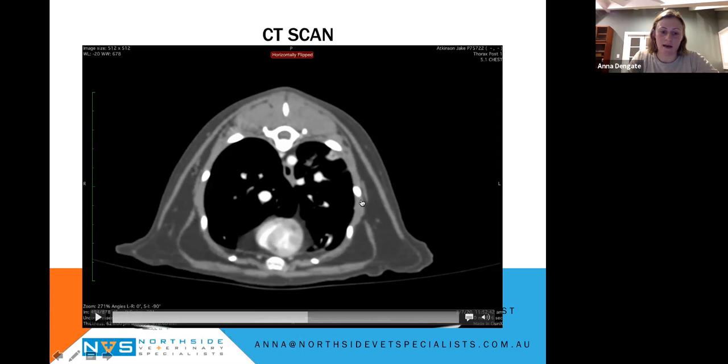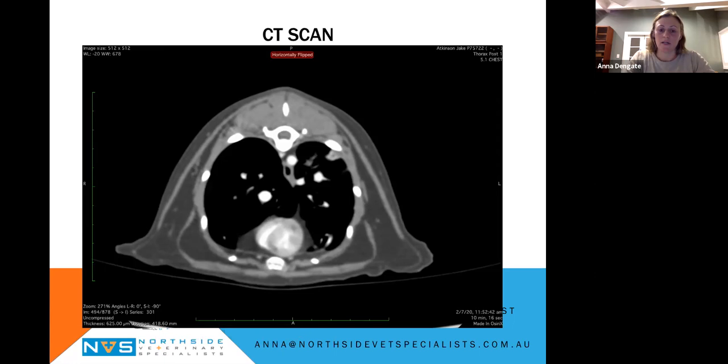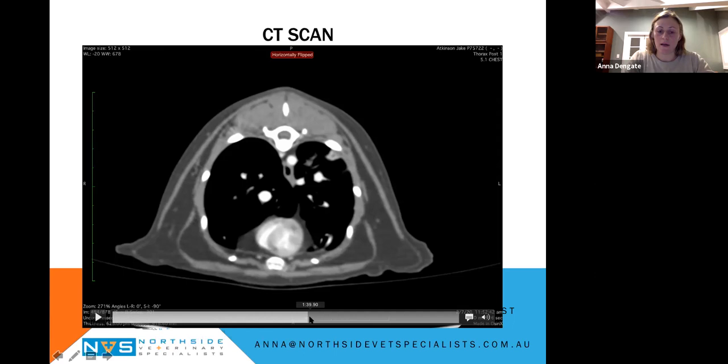And we had a lot of trouble tying that in with why this has happened immediately after vomiting. Again, we checked the right atrium, had the right side of the heart reviewed on CT scan, and there was no evidence of right-sided cardiomegaly. Apart from that clot in the pulmonary artery, we couldn't see any evidence of heartworm or anything, but we did run heartworm antibody and antigen titers just to be sure.